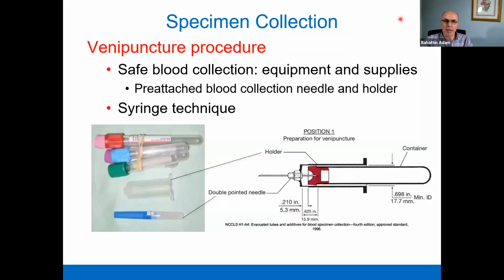Venipuncture is one of the most common procedures in which we collect blood.